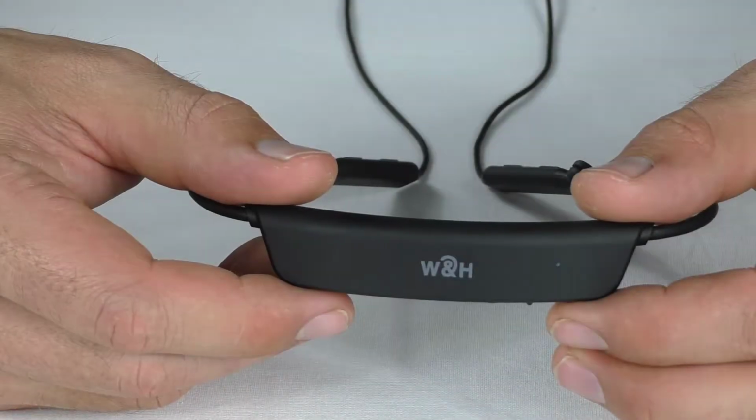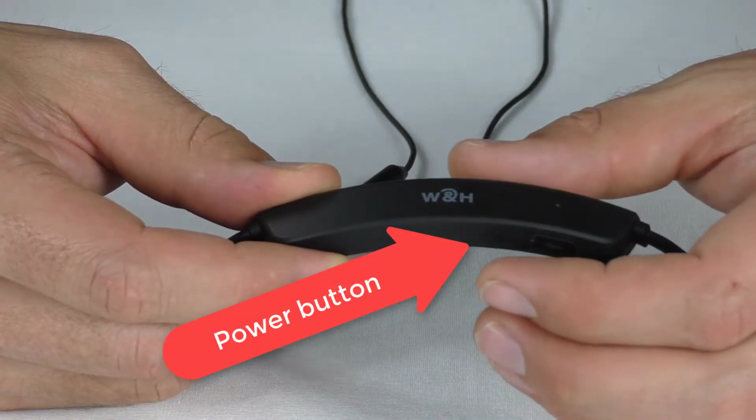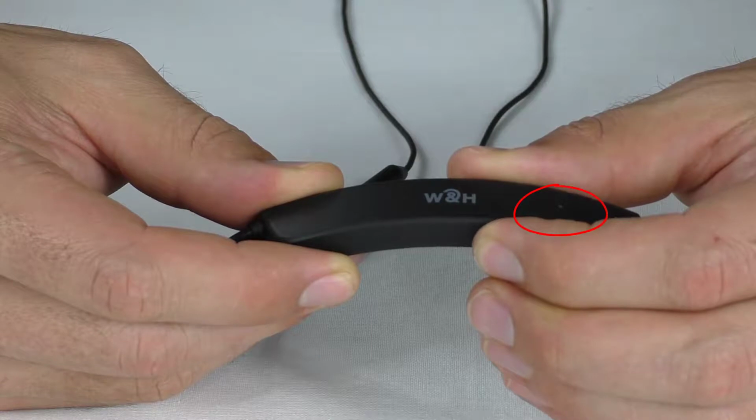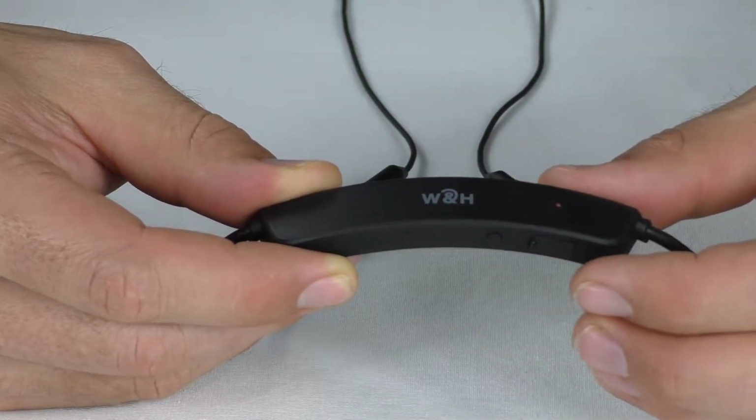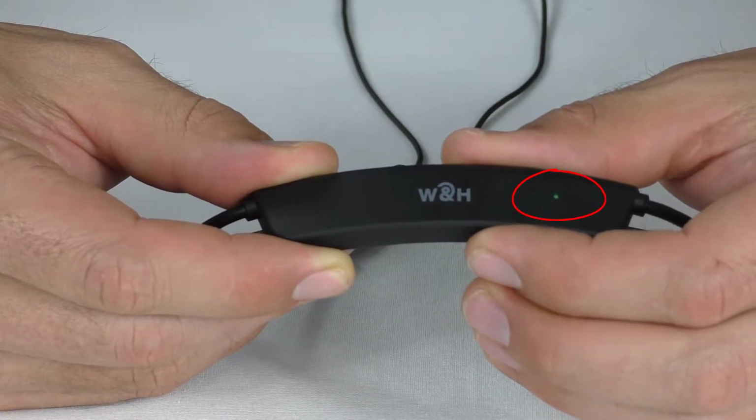Checking your BeHear Now battery level is very simple. There are two ways of doing this, either on the headset itself or using the smartphone app. To check battery level using the headset, turn it on by pressing the power button for 1 second until the LED is light blue. Then press the power button again for less than 1 second.